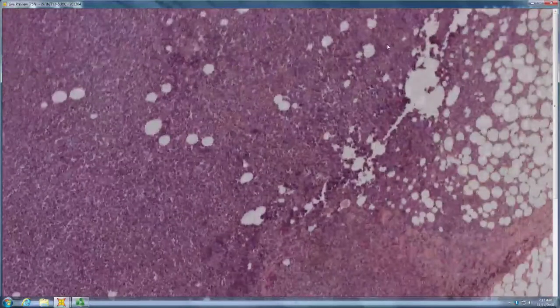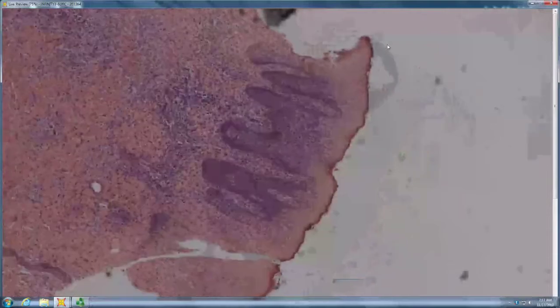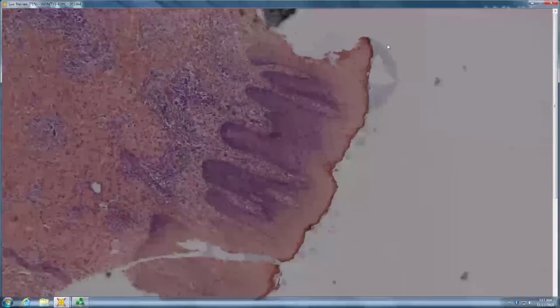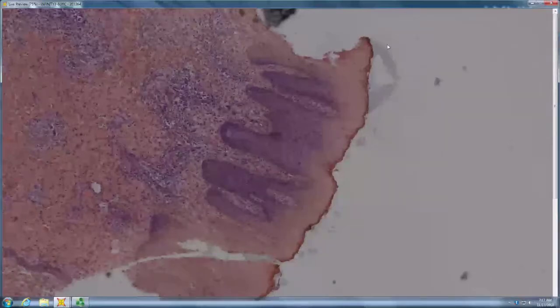And so this one with the plasmacytoid B cells, it's not particularly rimming like a subcutaneous panniculitis-like T-cell lymphoma. There is maybe a little dermal involvement. Certainly there was something interface at the junction. That's something that, especially if there's karyorrhectic debris deep, brings up the possibility of a gamma delta lymphoma. They tend to have sub-Q, dermal plus junction, and karyorrhectic debris deep.